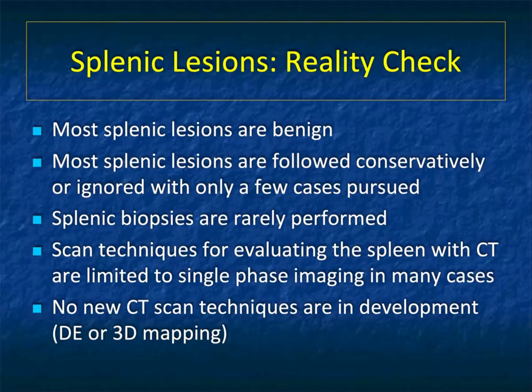Now, when you think about incidental splenic lesions, before you get too excited, there's things we all know. Most splenic lesions, surely incidental ones, are benign, and they can be followed conservatively or not followed at all. We rarely do splenic biopsies. Scan techniques for evaluating the spleen are somewhat limited.